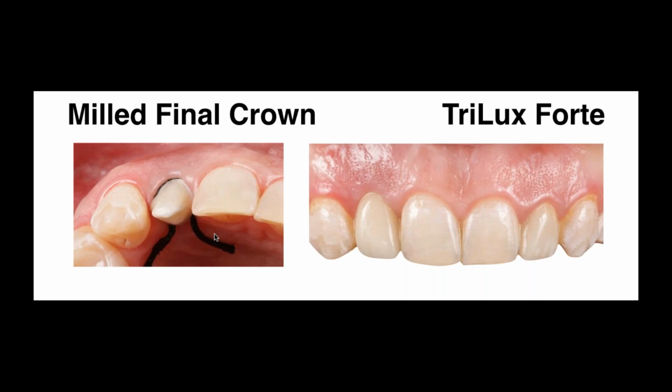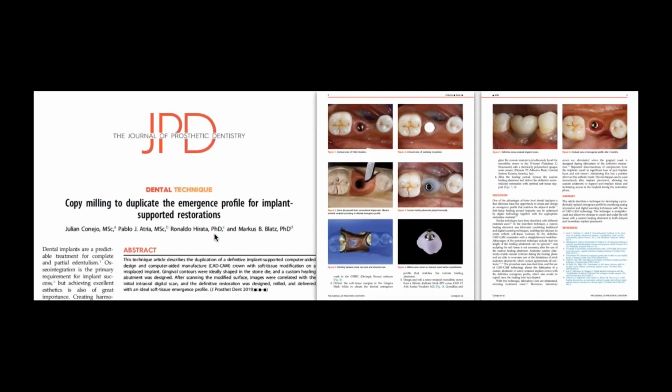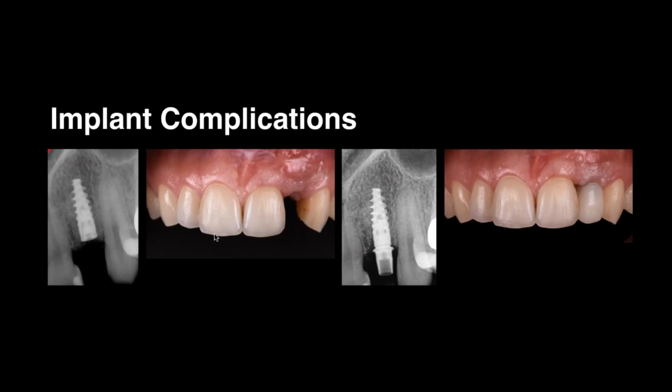And we use the zirconia abutment as we use a normal prep abutment, and cement these types of ceramic restorations. There are many ways to trick the software as well, but I think that we should put more emphasis nowadays on creating an ideal soft tissue emergence profile, and making these custom abutments is very helpful for idealizing the emergence profile of any implant-supported restoration.